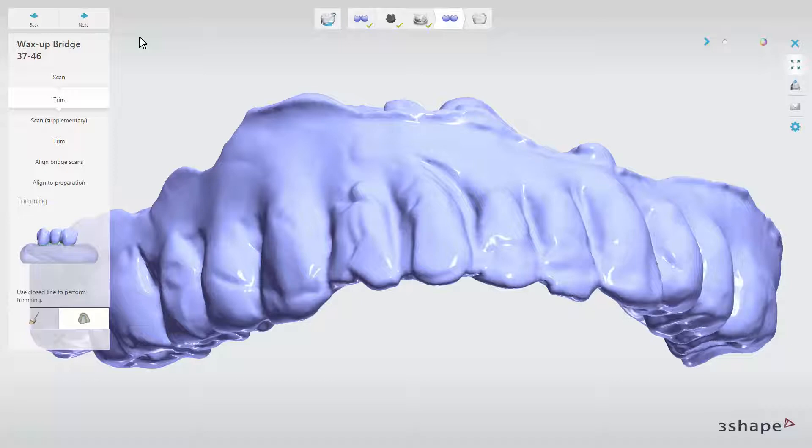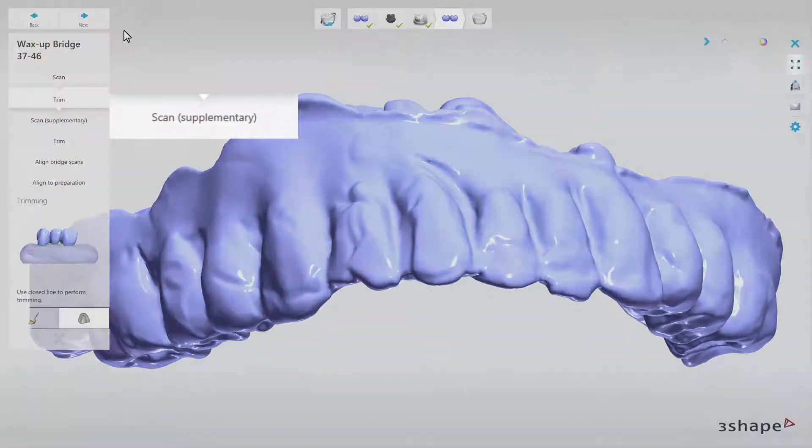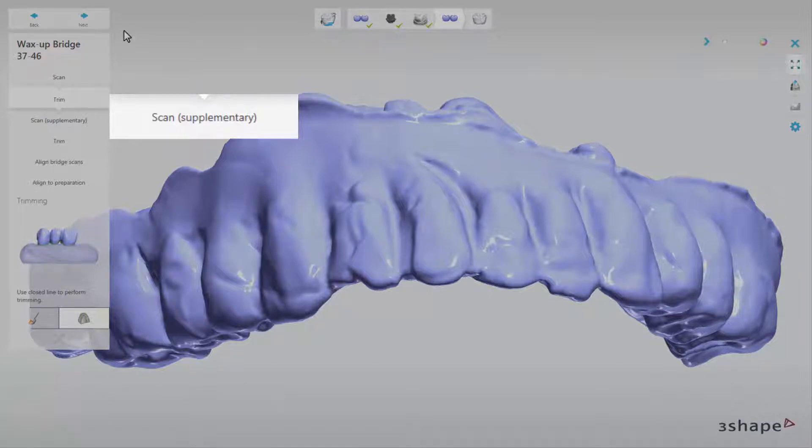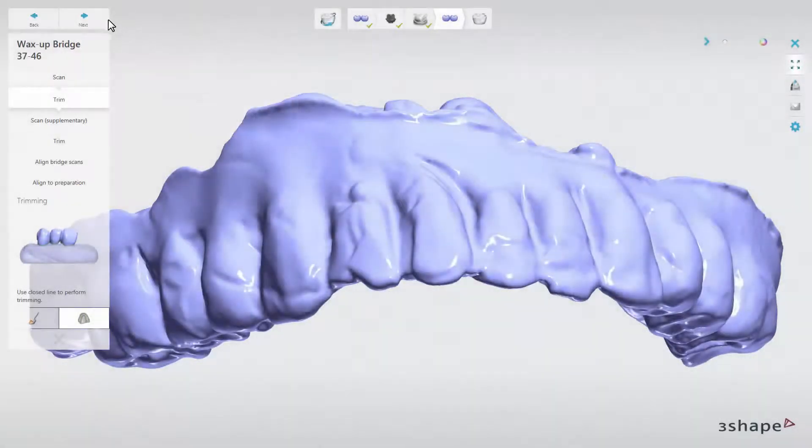The next sub-step is optional. After trimming, you can move to the Scan supplementary sub-step. By doing this, you can flip the wax up model upside down and scan it from the other side.